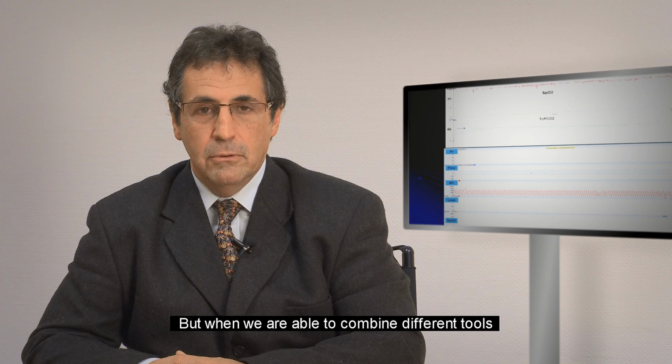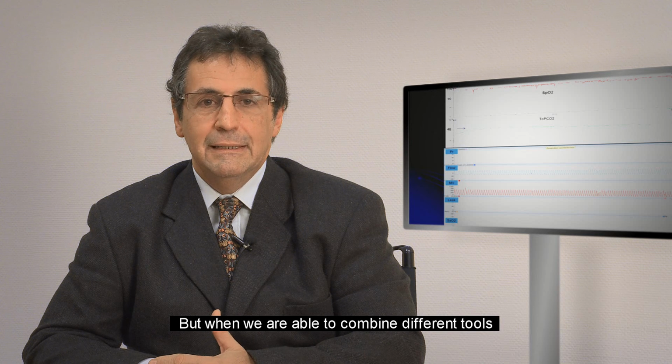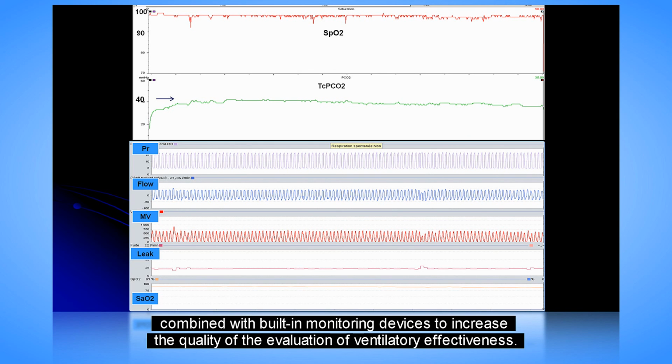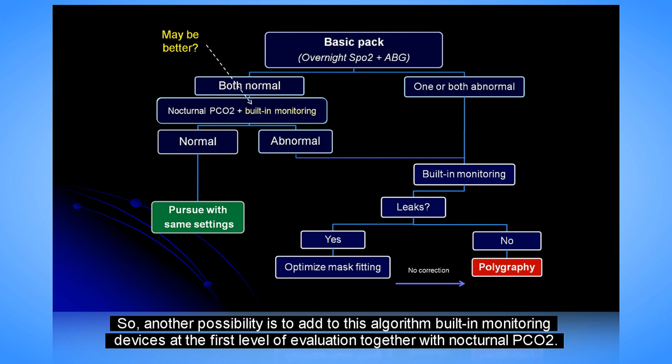But when we are able to combine different tools, it is possibly more interesting to use non-invasive and not cumbersome tools such as oxygen saturation and capnography combined with built-in monitoring devices to increase the quality of the evaluation of ventilatory effectiveness. So another possibility is to add to this algorithm built-in monitoring devices at the first level of evaluation together with nocturnal PtcCO2.